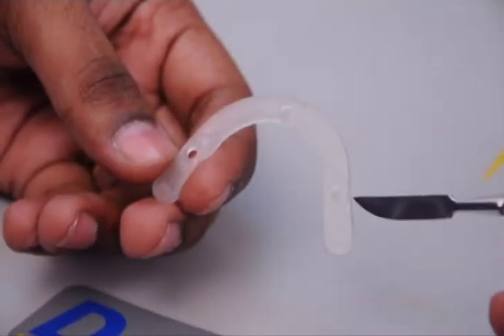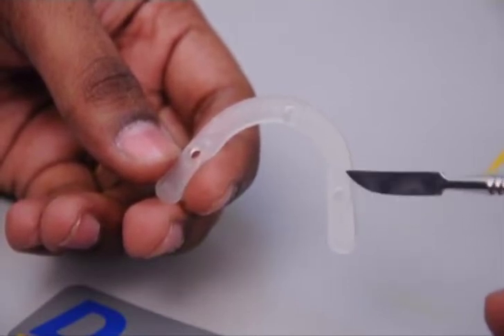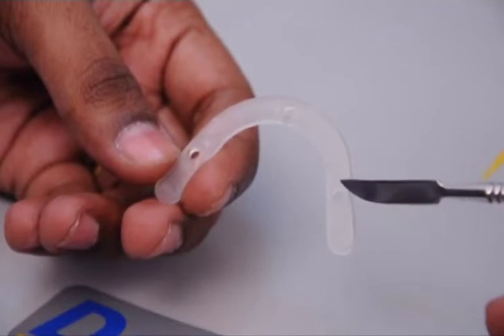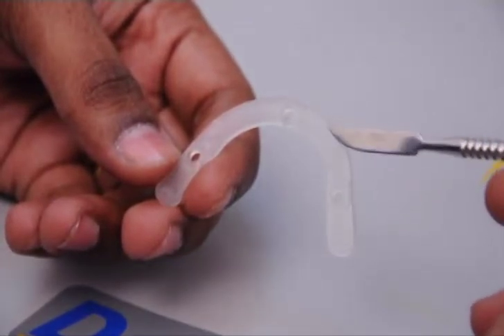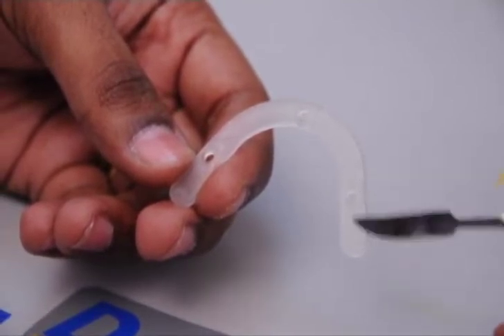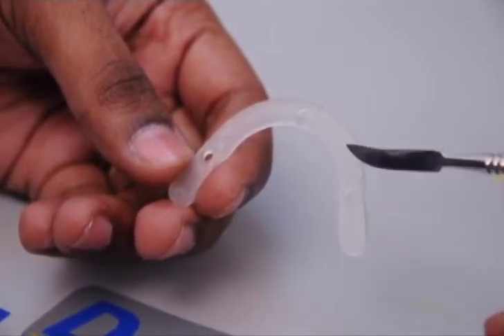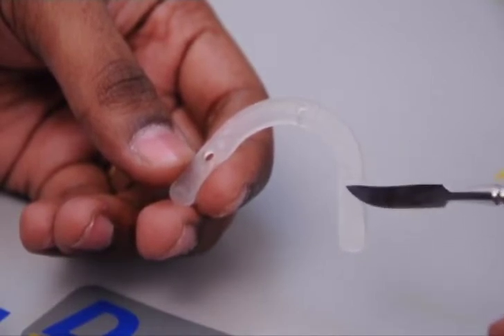These are the plastic bite rims, also called as the spacers. They solve two purposes: one, they provide space for the attachment of the tracers, and the other is, as the name suggests, they are plastic bite rims. So it is with this that we can verify whether the upper and lower denture bases are coming into approximation or not.